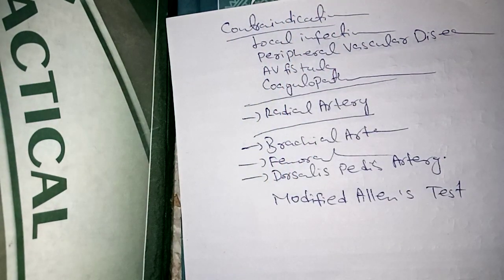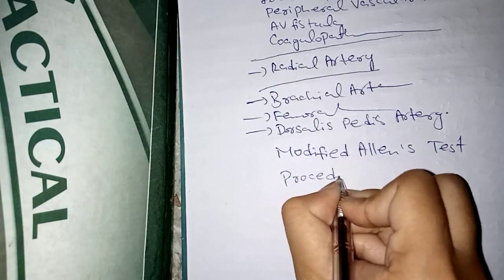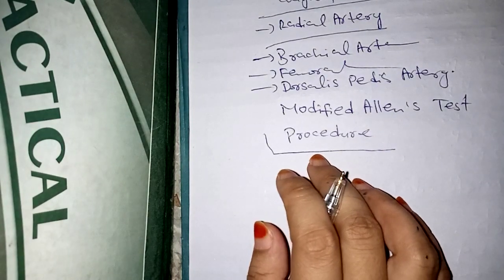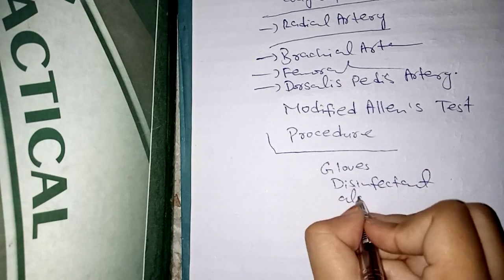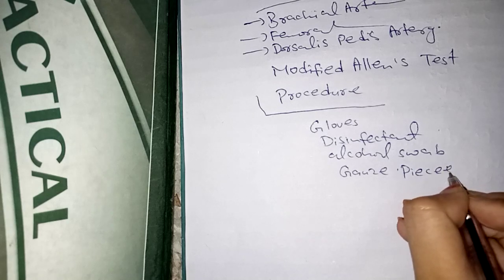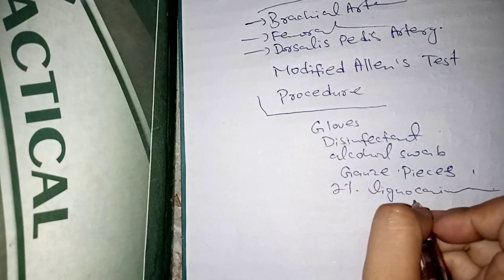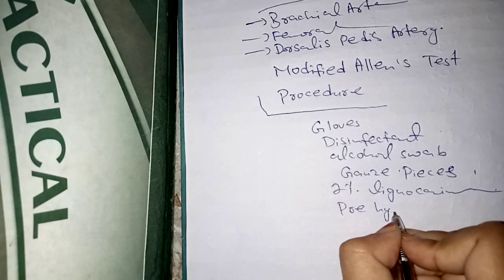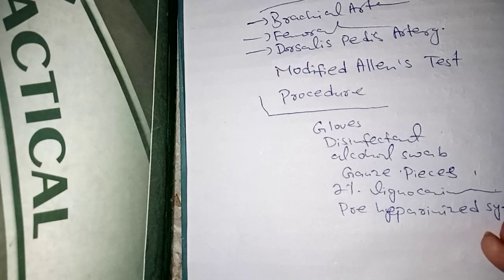Its procedure: arrange all the equipment like gloves, skin disinfectant, alcohol swab, gauze pieces, 2% lignocaine local anesthetic, pre-heparinized syringe, and 26 gauge needle.